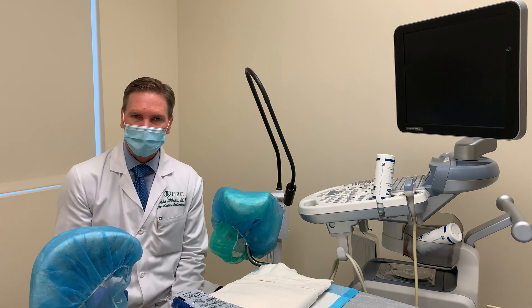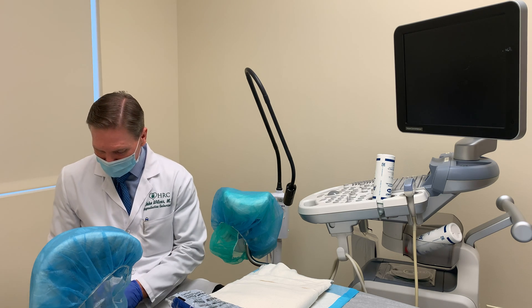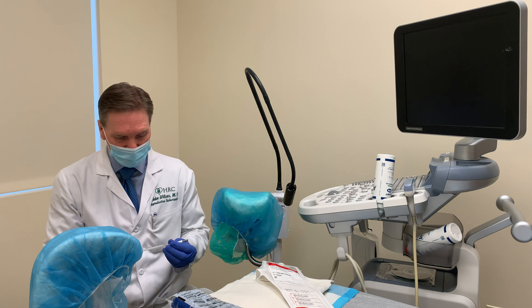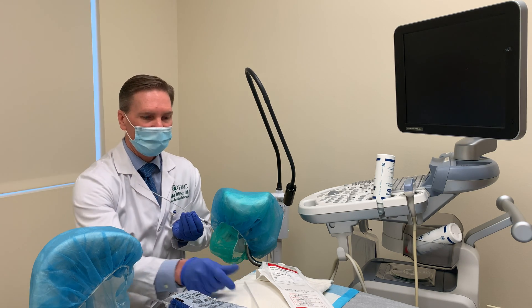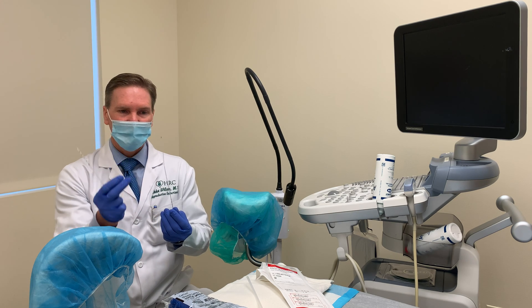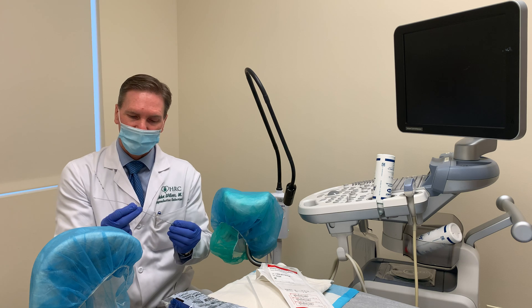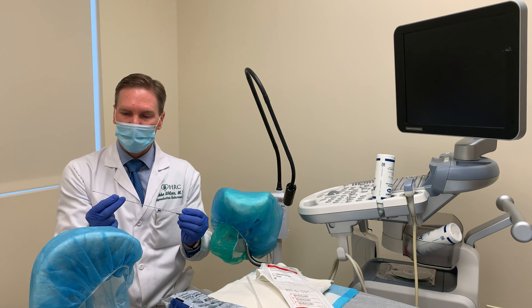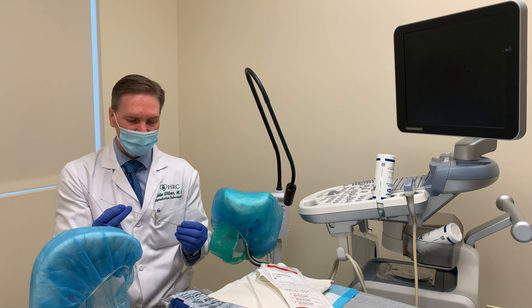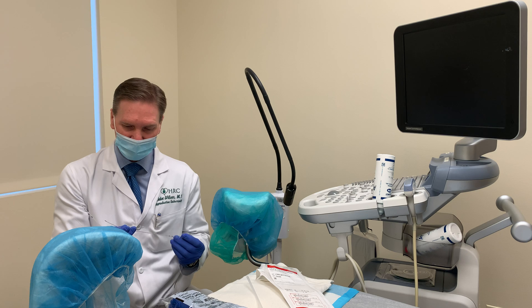Once the ultrasonographer has identified the location we want to deliver the embryos, we go ahead and use a very specific catheter. Here we have a Cook catheter that was designed for embryo transfer. These catheters are incredibly unique in the sense that the inner catheter is very soft — it's almost like a noodle of spaghetti. The inner chamber has very tight tolerance that allows what we call laminar flow. The laminar flow prevents eddies or turbulence that can trap the embryo and increase the risk of what we call a retained embryo. The catheters are a little pricey, but they consistently allow us to flush the catheter, release the embryo, and successfully place it in the uterine cavity.